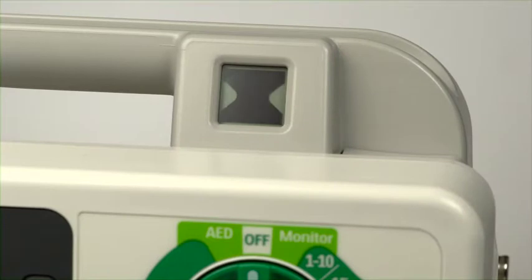This is the ready-for-use indicator. The flashing hourglass tells you that the device passed its last self-test and is ready to go with sufficient battery power for defibrillation, pacing, and ECG functions.